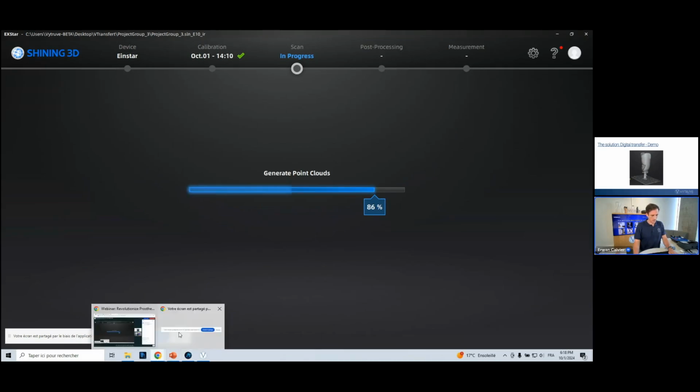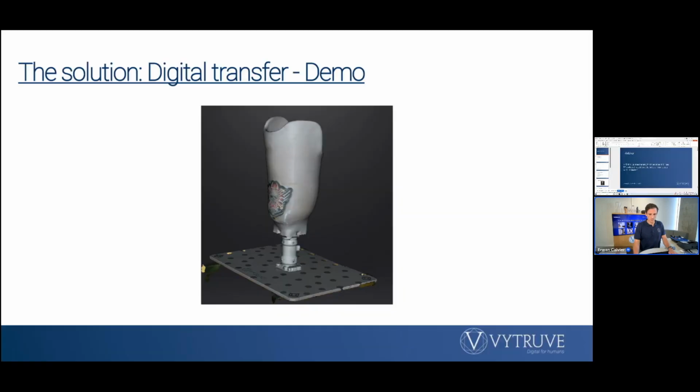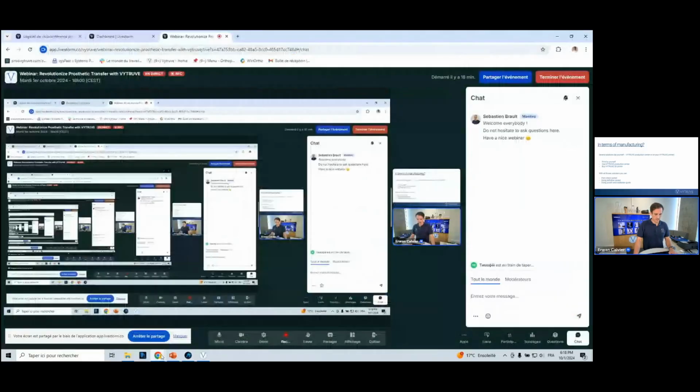So we are going to continue the presentation, and after you are going to come back. So as I told you, it's the digital transfer. After you are going to talk of the manufacturing, because it's another step. We do the transfer. Now it's necessary to manufacture everything. So I will come back on my screen here.